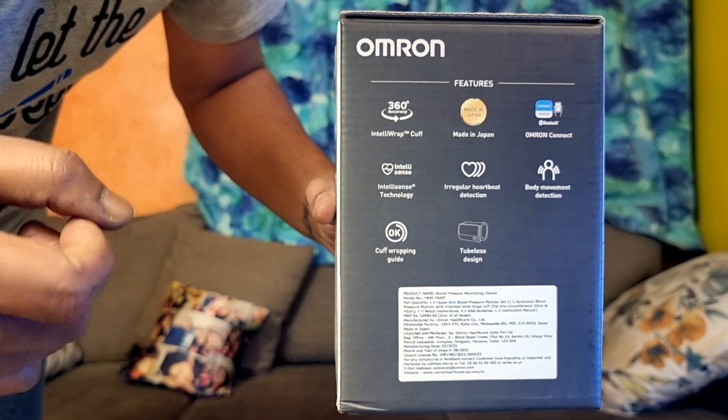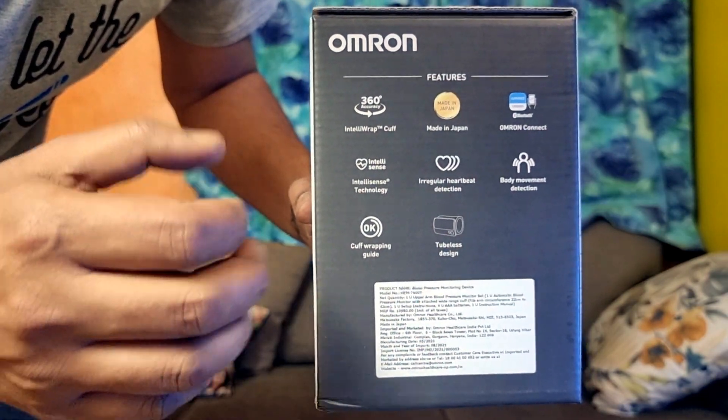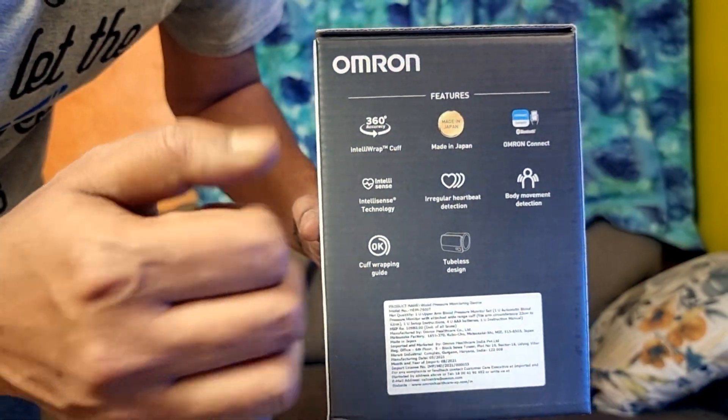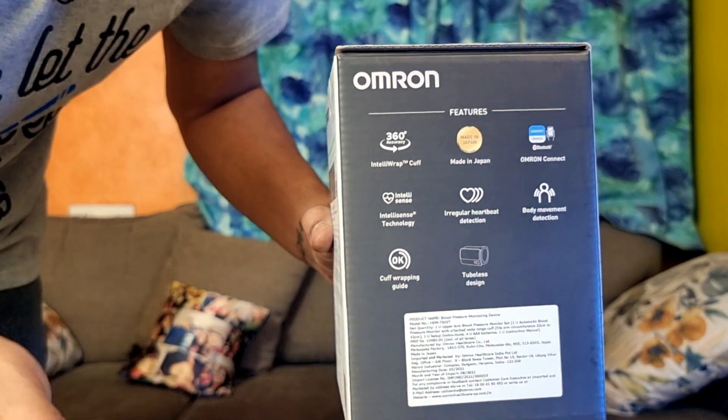This is the tubeless design, compact, and you can see the features of the smart connect, irregular heartbeat detection, and all kinds of things.